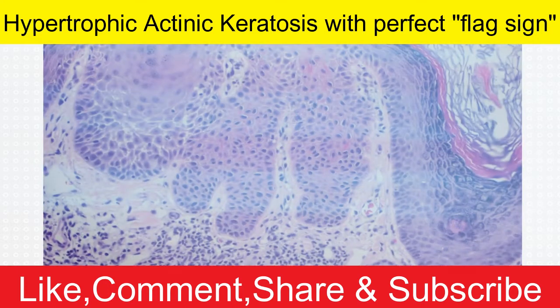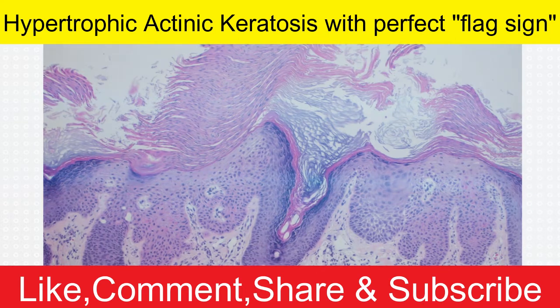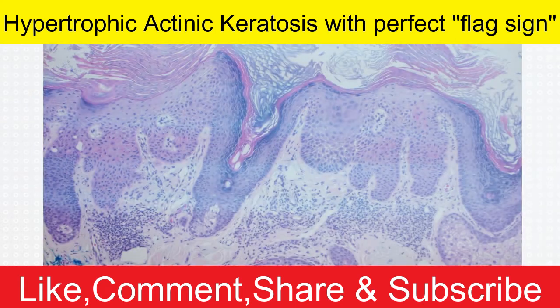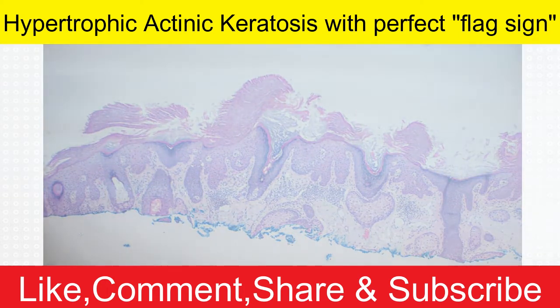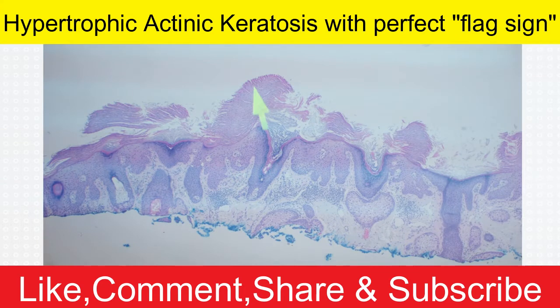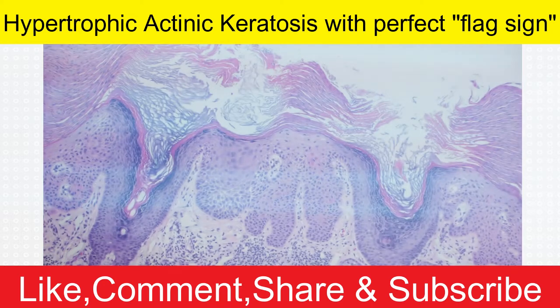You can also see another nice feature of this AK: actinic keratoses tend to make parakeratosis, and they also tend to spare the openings of adnexal structures, like sweat duct openings, acrosyringium, or hair follicle openings. This is such a nice example because you can see it really well here. You've got parakeratosis, and then it skips past this hair follicle opening, and over the hair follicle you have nice loose basket weave orthokeratin, and then you go back to that dense, compact pink parakeratosis.